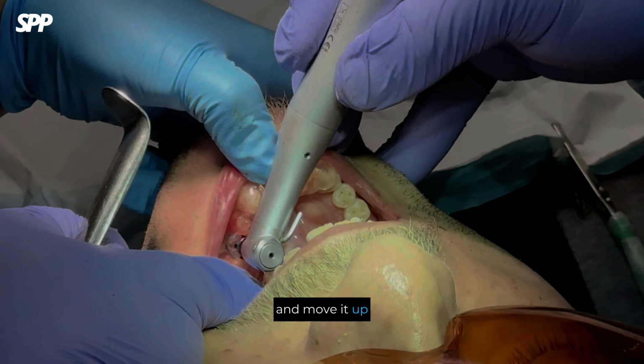I attached the smart peg to the fixture and measured the ISQ. The value was above 70, confirming that the implant was suitable for immediate loading. After fixture placement, I took an X-ray to confirm the position. I used the R2 milling center to prepare the custom abutment, and the result was milled very well. The R2 milling center is based in New Jersey.